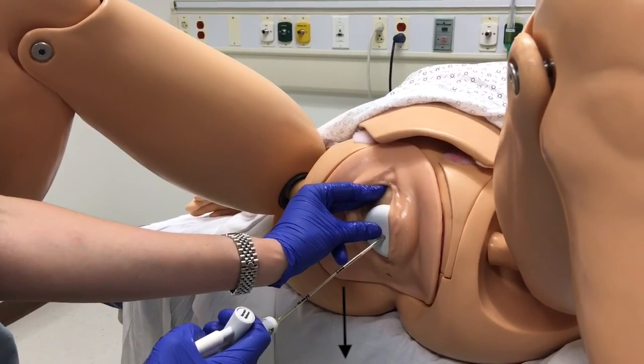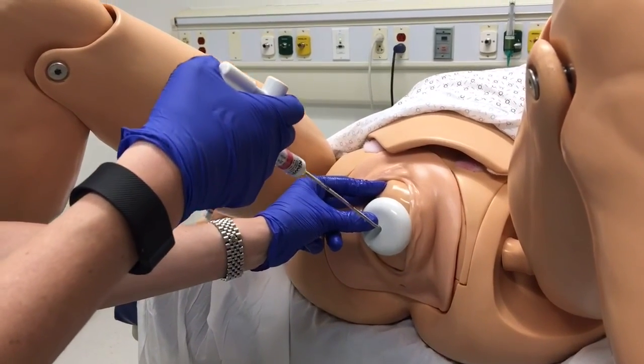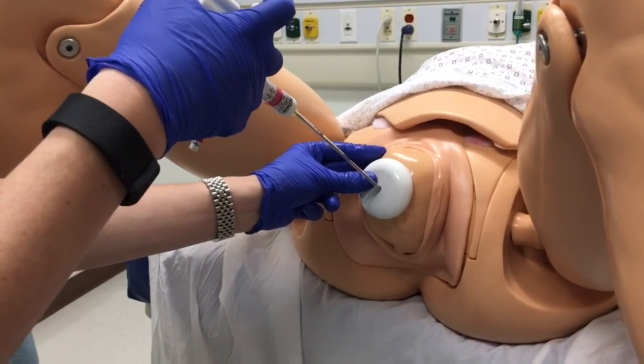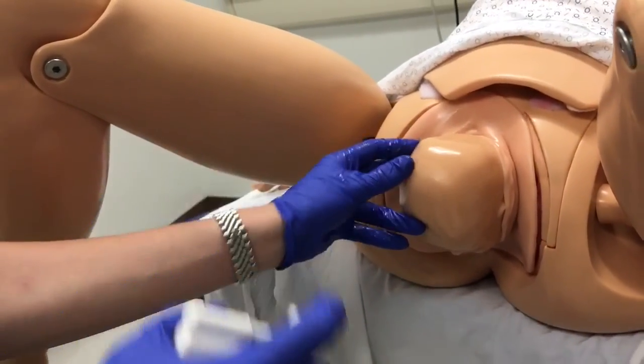The angle of traction will initially be downward as baby goes under the pubic symphysis. Gradually, the vector will become more upward as the head is delivered. You should notice progressive descent with each pull. Once the fetal head is delivered, release the vacuum and proceed with the normal steps of a vaginal delivery.